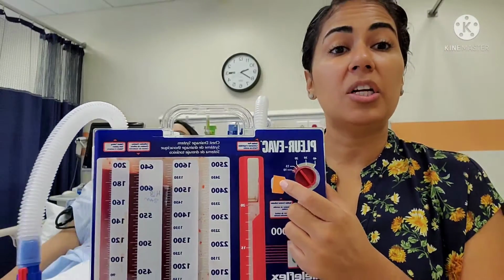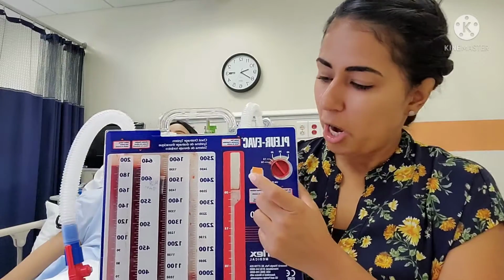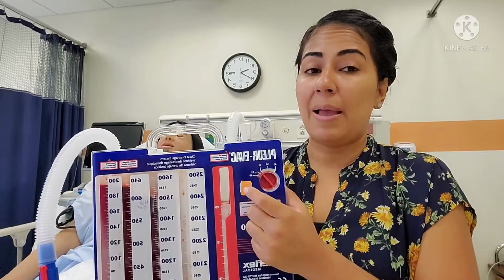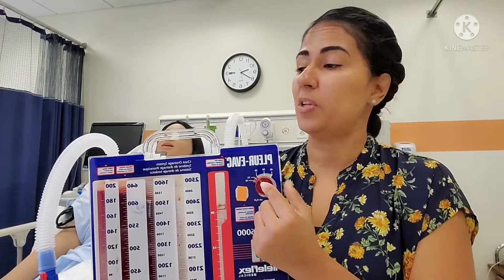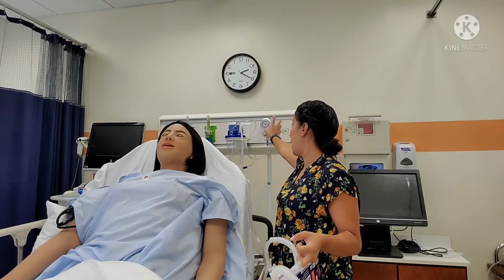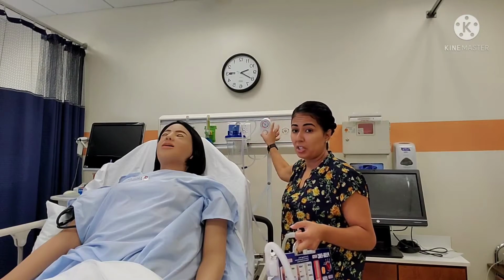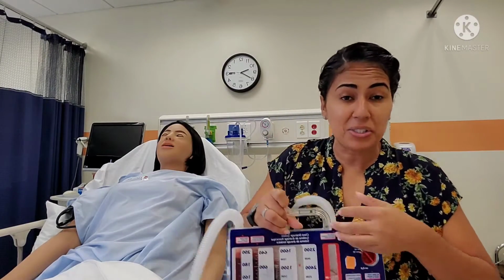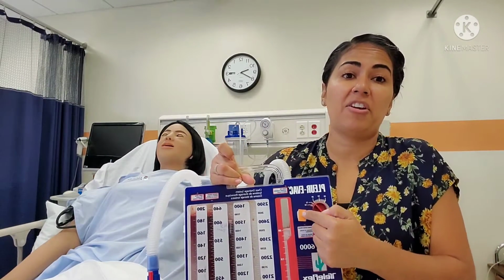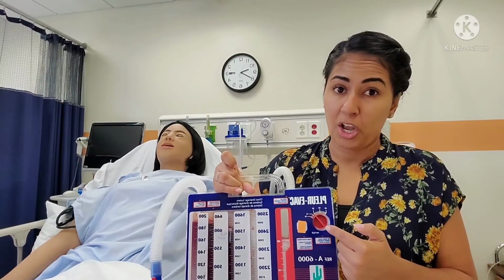The next thing that I'm going to look at is this indicator right here. And this is why I love dry suction. It's so much easier because all I have to do is make sure that my orange bellow is here to let me know that I'm suctioning at this 20 centimeters of water. Now, here at my head wall, I am suctioning. I have my suction gauge on, okay? And everything looks to be working well. But what really matters is that once my suction is on, I see this orange indicator here that's letting me know I'm suctioning at the provider's order, which is the 20 centimeters of water, okay?